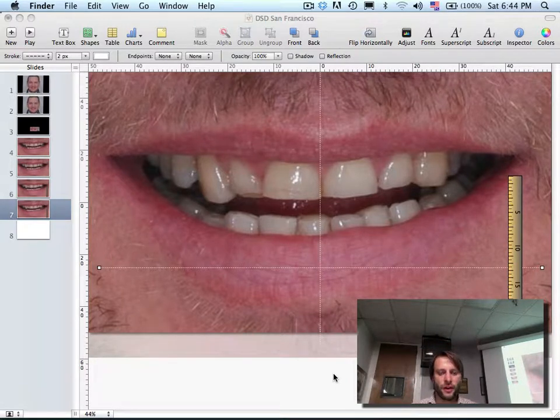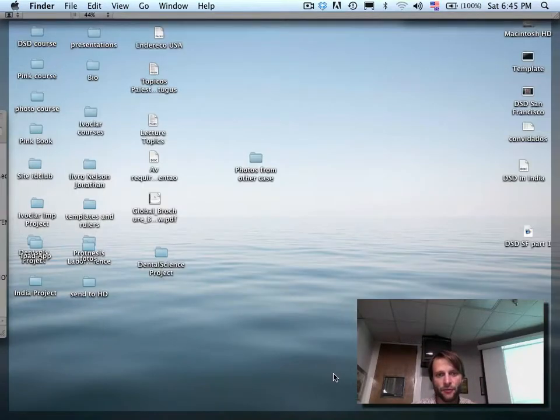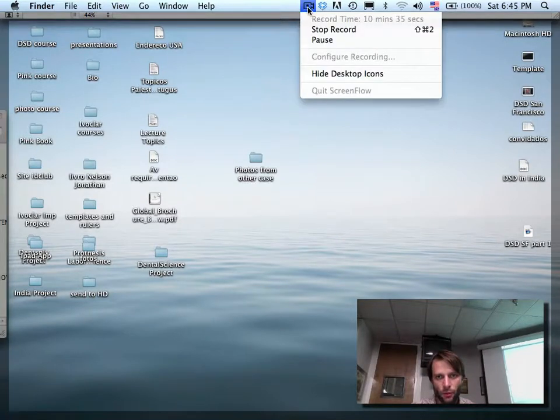So how do I make this drawing? I can either do the drawing first to guide me through this guessing process, or I can look at the video and try to see how much I can lengthen. Usually what we see is some dentists like to look at the patient speaking and guess how much they think it should be longer. Or you can look at the pictures, the main pictures, as I mentioned, at rest, 12 o'clock, profile, etc. And at this point we have to bring in some very important information that I will share with you right now.